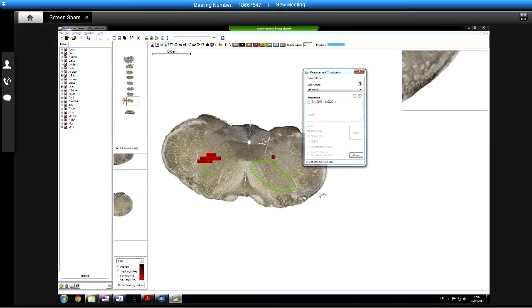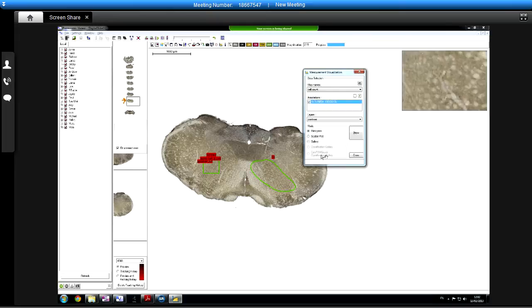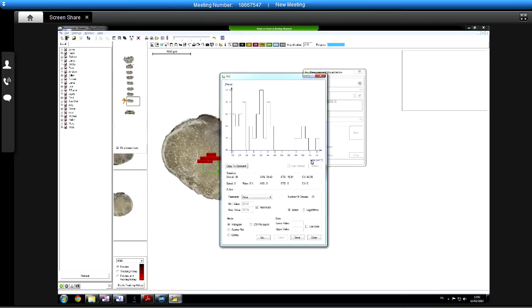So what this allows you to do is to reanalyze the data a little bit, if you like. For instance, if I click on area and go histogram, and then hit show. There's a number of parameters here, so I can pick area, or some of the intensities, for instance. I can pick the area, and this is just showing me the distribution of the areas at the moment. But say we now are only interested in the data for the smaller ones. I can use gates here, and then I can just drag this down and say I'm only interested in those ones there.